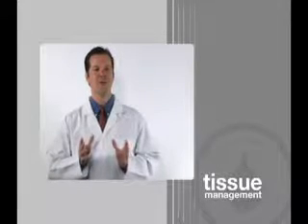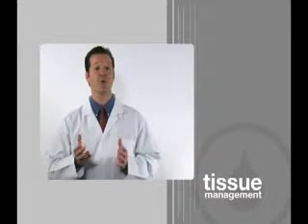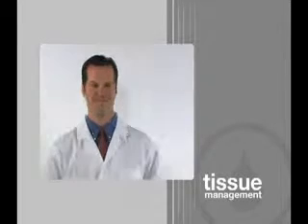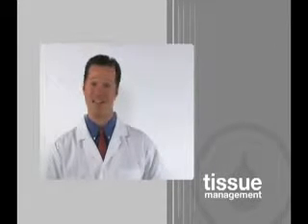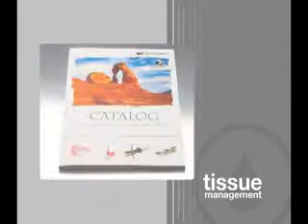By following good sulcular fluid management techniques, whether for impression making or restorative prosthesis bonding procedures, the integrity and longevity of the restoration is maximized. Today, the infusion technique of tissue management has become a prominent feature in dentistry and has gained clinical acclaim for its effectiveness and predictability. Additional uses for these materials are taught in ULTRADENT's Materials and Procedures Manual.